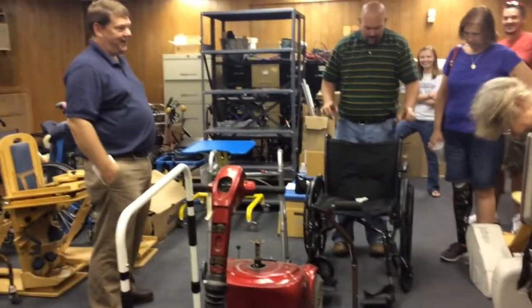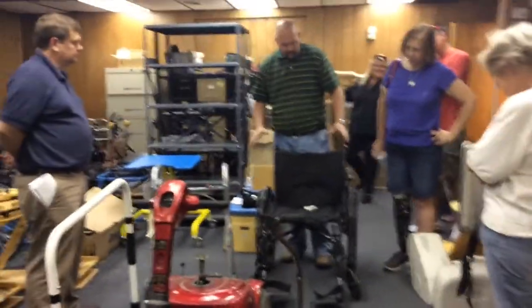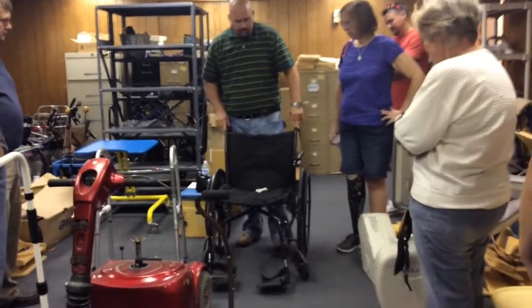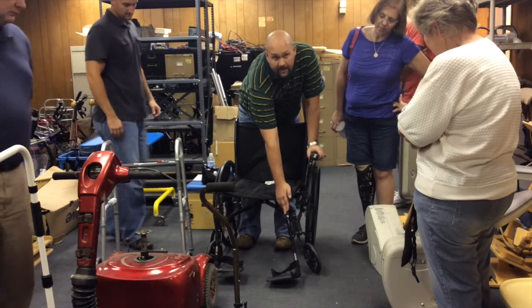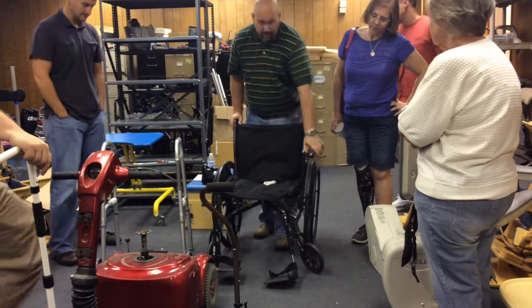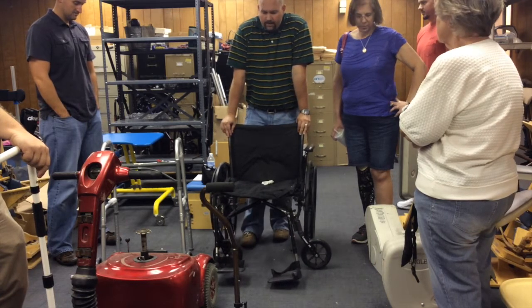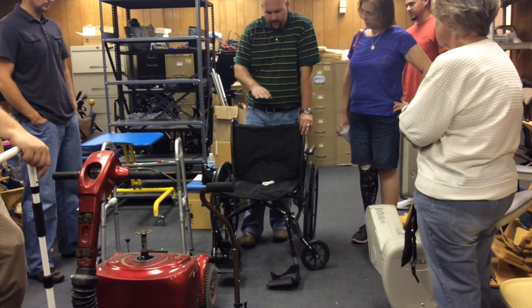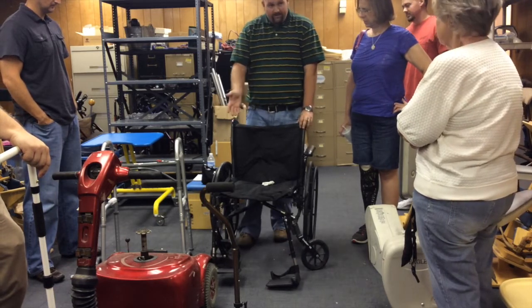Not yet. So we know this is a scrap — the chair itself is no good. But there are parts on this chair that may be usable. Every pair of footrests you get, put them in your hold stocking area, because most chairs that come in do not have legs. All manufacturers don't use the same legs, but most individual manufacturers' legs will fit their different styles. So if you've got a Drive brand, those legs are going to fit most Drive-manufactured chairs.